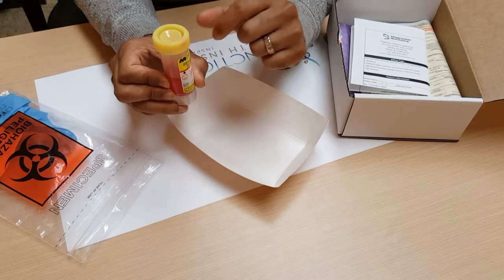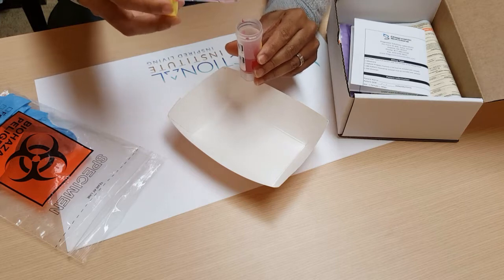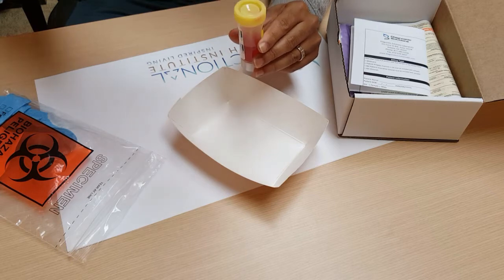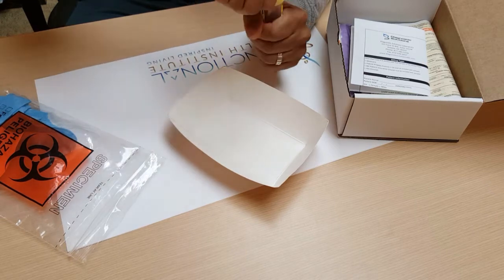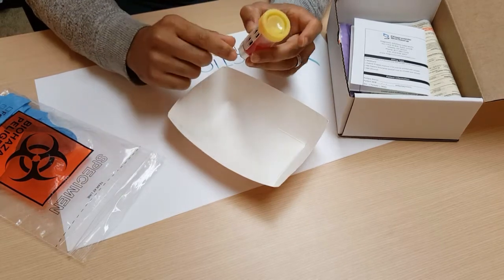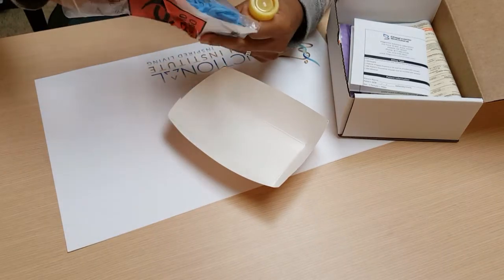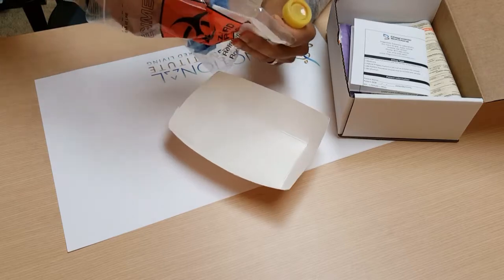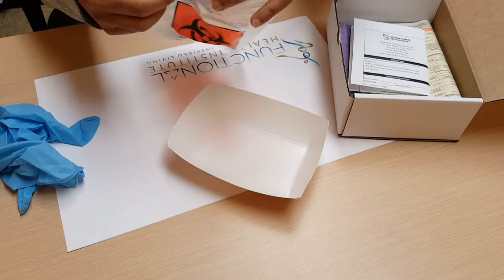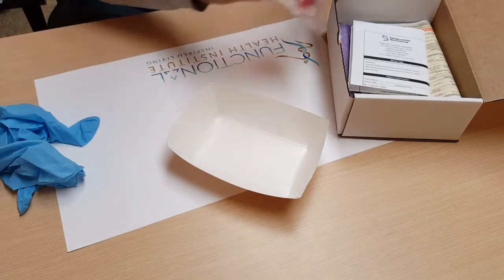Only fill the red solution up to the red line. Once you have your sample in the vial, use the spoon to stir it and get it to a liquid consistency. Then tighten the lid back up as tight as it gets and shake it for 30 seconds. After shaking, — with your gloves on — place the vial and the absorbent pad into the plastic bag, seal it, and put it into the box.